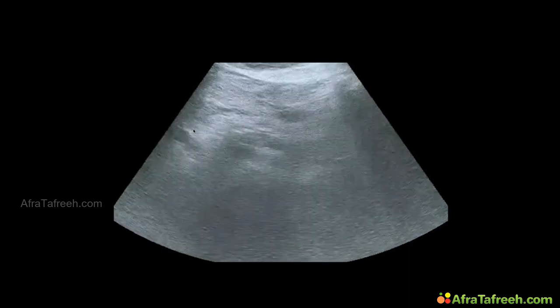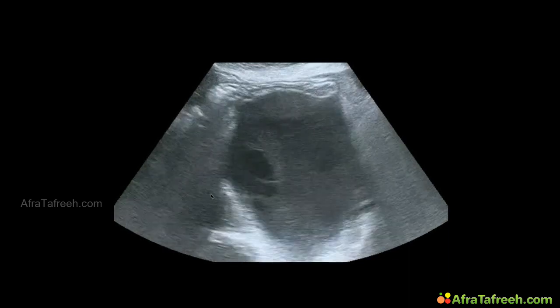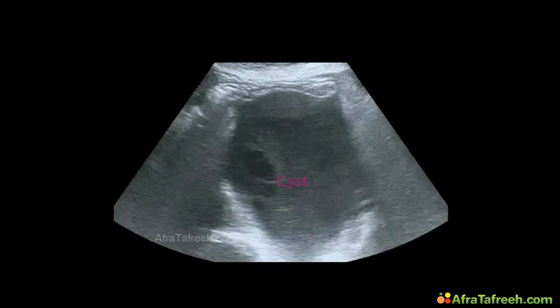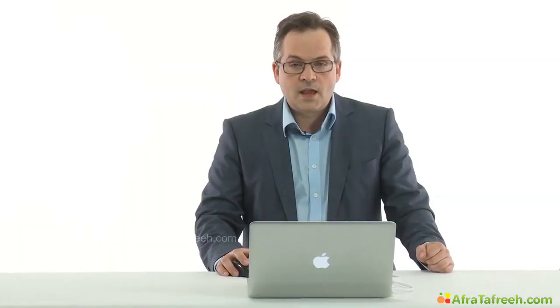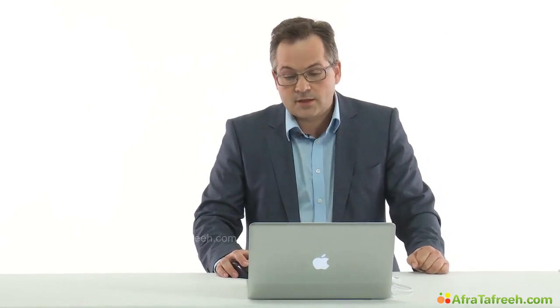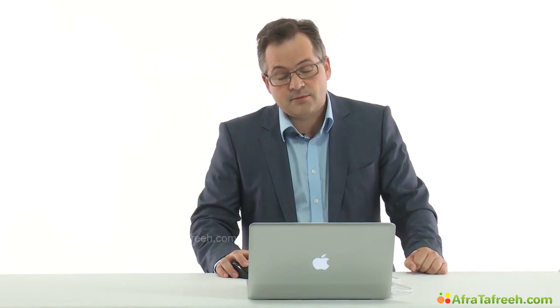There's the aorta. We have seen the pancreas and this tremendous huge cyst at the region of the tail of the pancreas. In the follow-up examinations, the cyst showed growth and the complaints of the young patient became even more intense. So something had to be done.